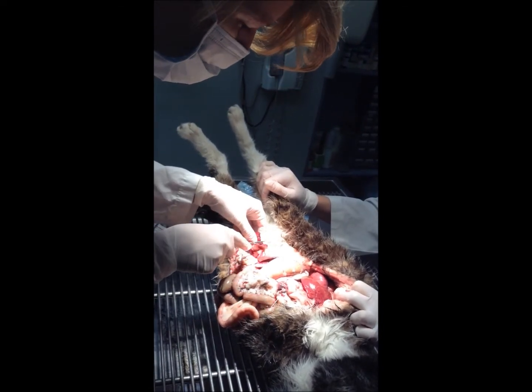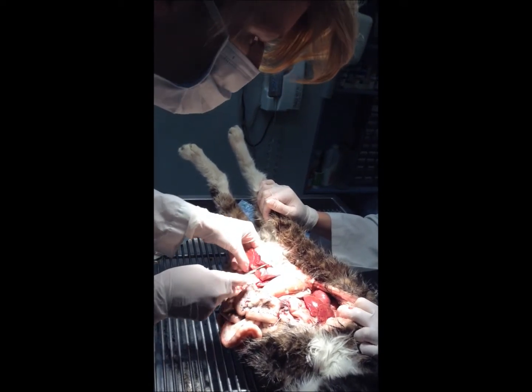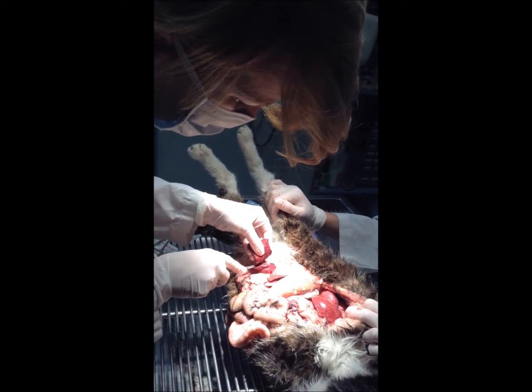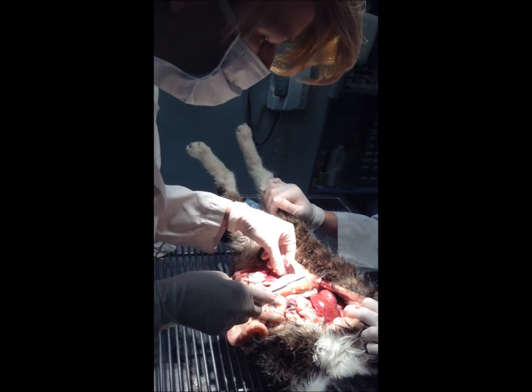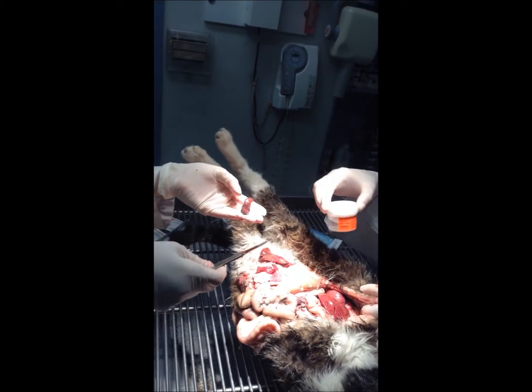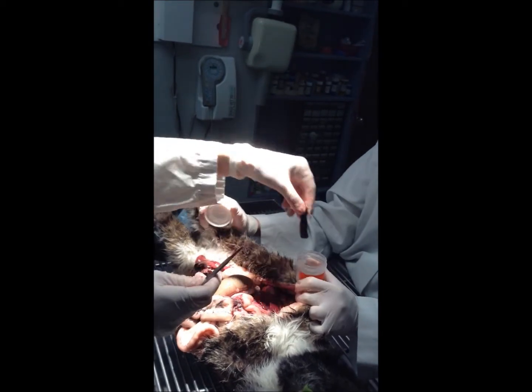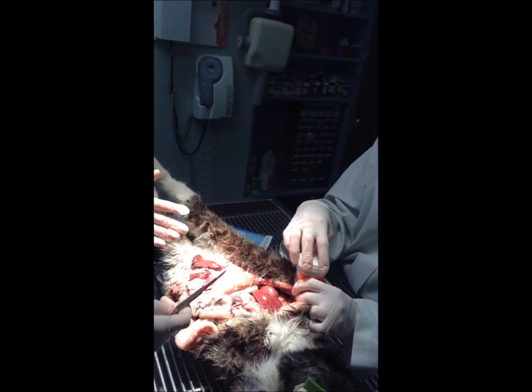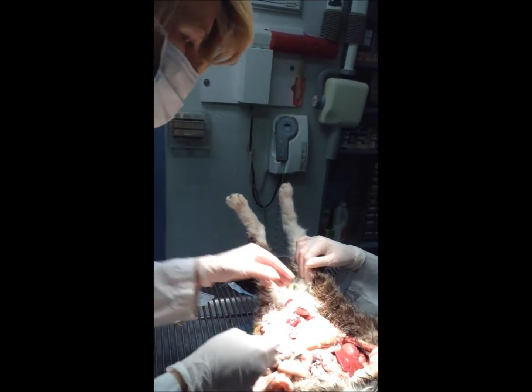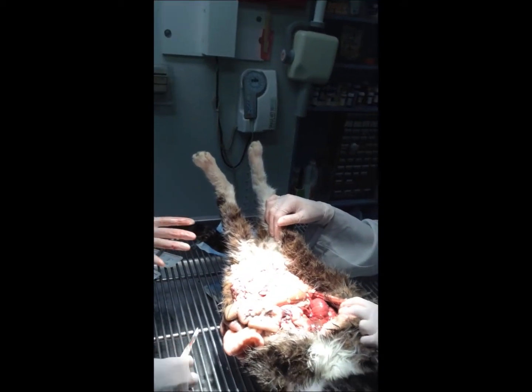So depending on where we have pathology, if it's to submit multiple samples, in this case, this cat says diffuse disease, so it's not a particular area of the spleen I want to submit. So we'll just submit one of these slices, and we want to put them in formaldehyde in a container. This container's a little small. We need to usually submit this in a container that contains about 10 times more fluid than the actual tissue. But depending on what tissue you want to submit, you take a certain piece and send it up, and that's it.